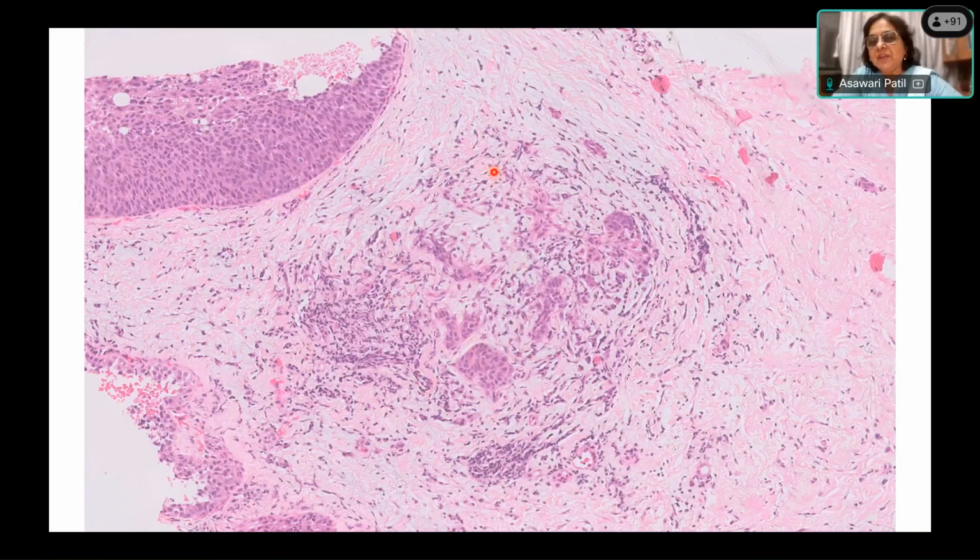Now, this kind of reaction you see, all of you remember, this is usually the reaction for invasion, okay? So to call something epithelial displacement, which is quite rare, not very common, we don't have any FNAC or prior biopsy tract. So I will not call it. The nuclei look the same. So to me, it's more likely going to be invasion. Okay. So now once we have decided that this is invasion, what is next? What should we do?